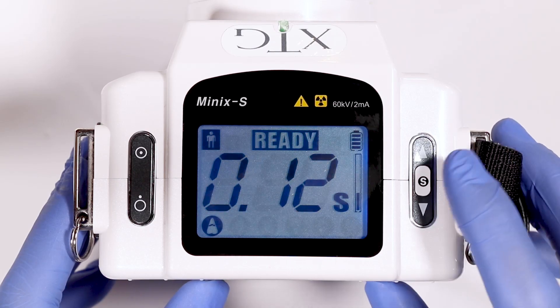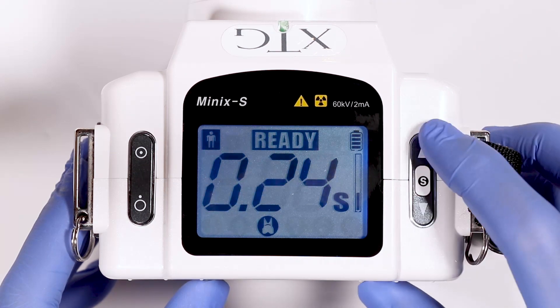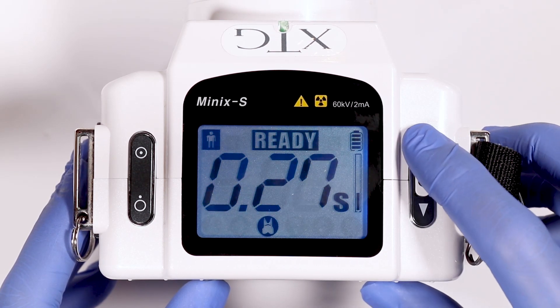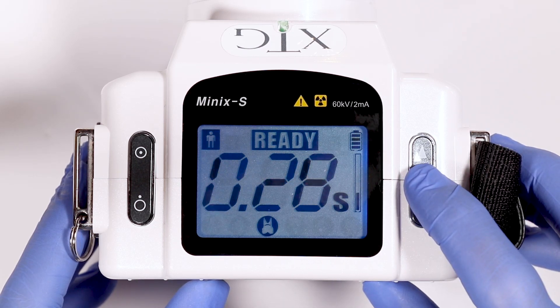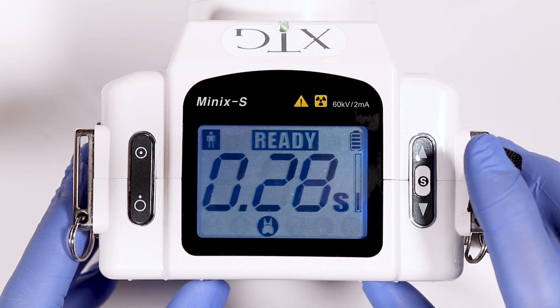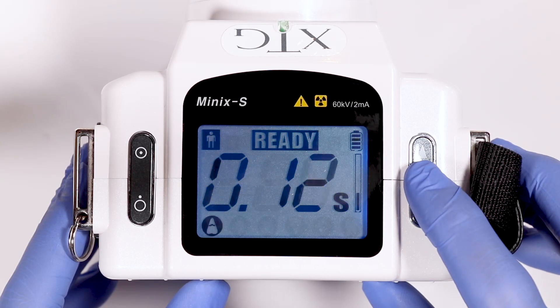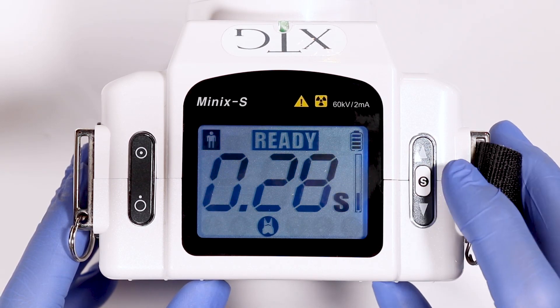The XTG settings. Press the S button to scroll through the different tooth types. The up and down arrows will change the exposure time for each tooth setting. Press the S button for two seconds, then press the S button again and the new exposure time will save. Notice as we go back to the molar setting, it is now saved to 0.28.